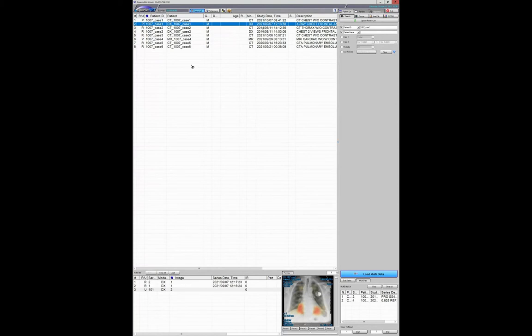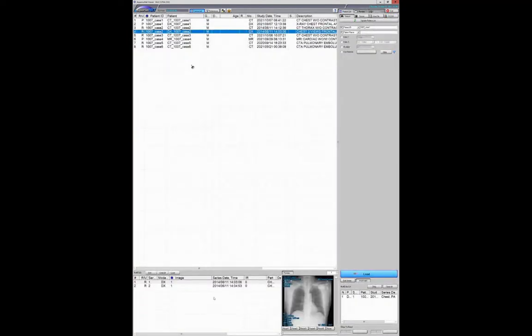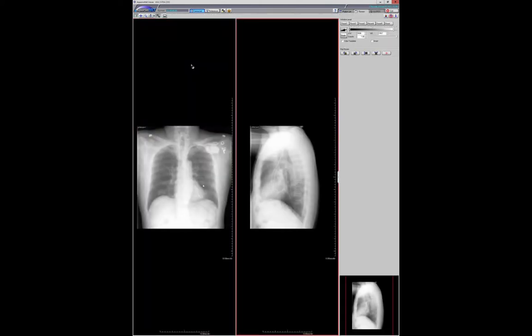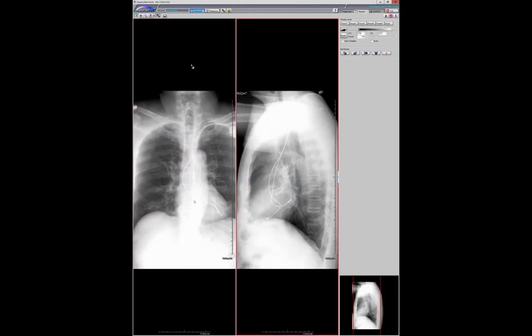I would think they would be able to discover abnormal sensing, since I presume they do some kind of routine interrogation of the function of leads after placement, even if the procedure goes smoothly. Well, they always get a chest x-ray at least. The chest x-ray would say, hey, this doesn't look right. But who knows? Unless they're walking around with transposition. Good golly. Anyways, those are my guesses.